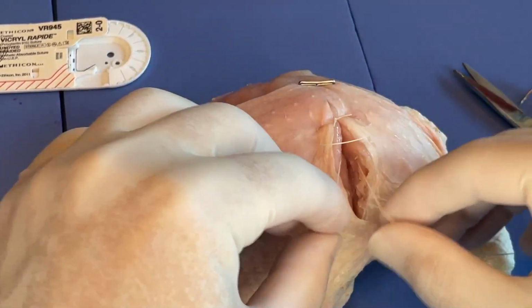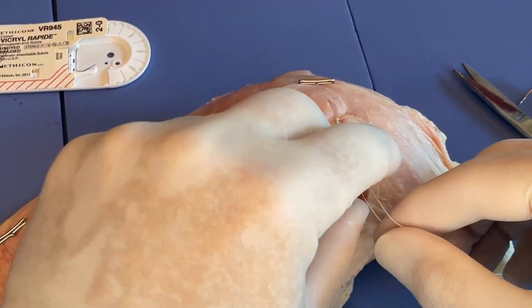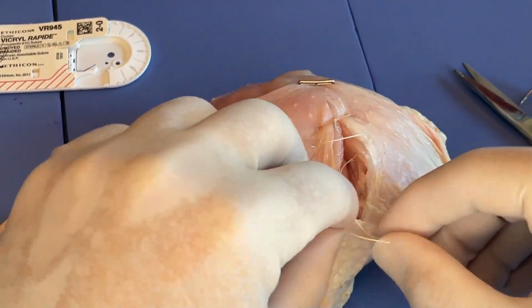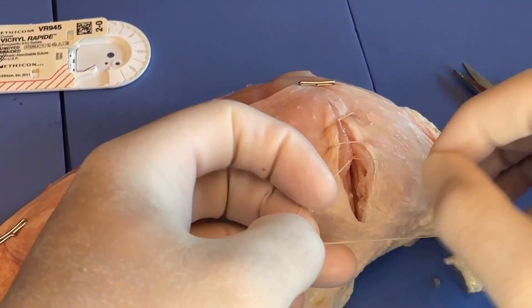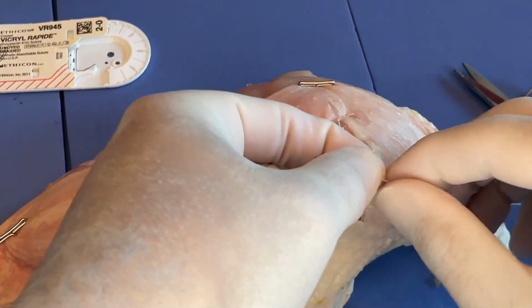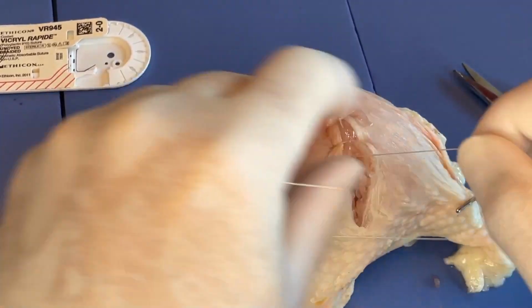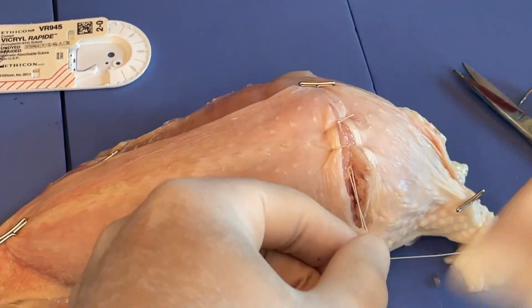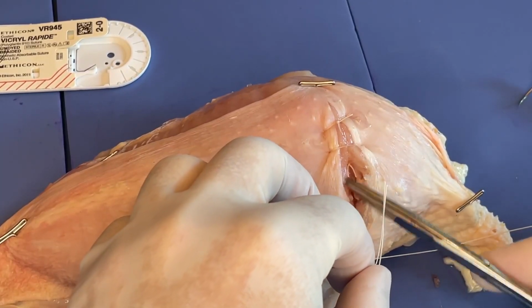All right, so now you can see that our loop is on the outside, so to speak, and our free end and the part that the needle is on are exiting down deeper in the tissue. So once we get that set up, we're just going to do, again, over the thumb first, and then tighten that down, over finger, over thumb, over finger, so 4 throws to complete square knots. And then you can see that our knot is down here in the tissue itself.